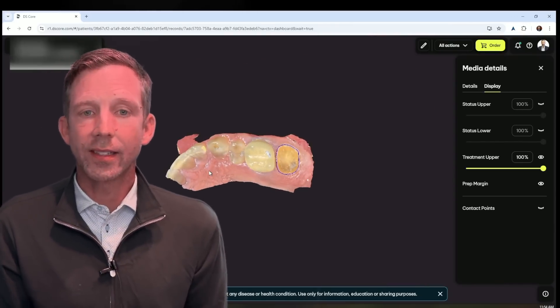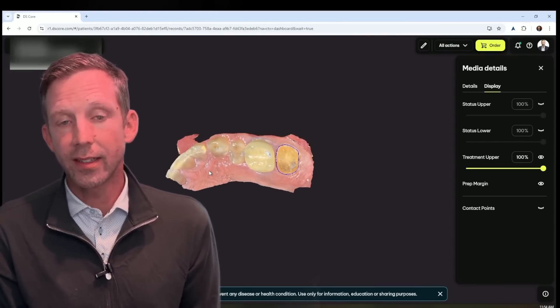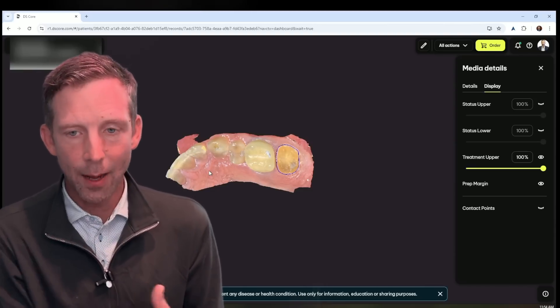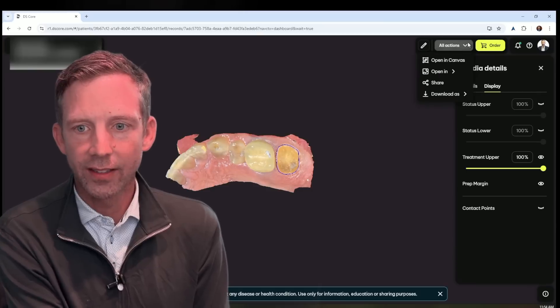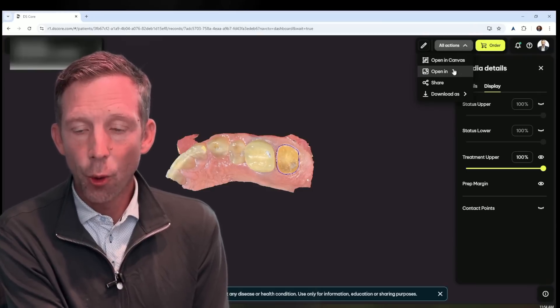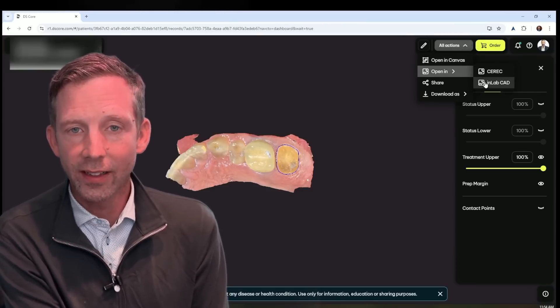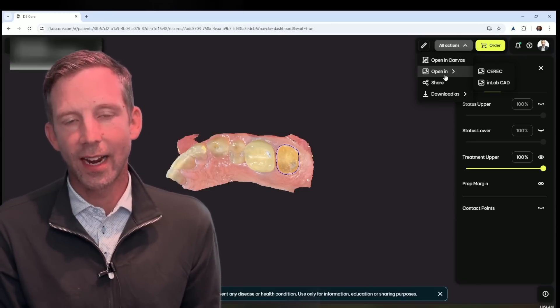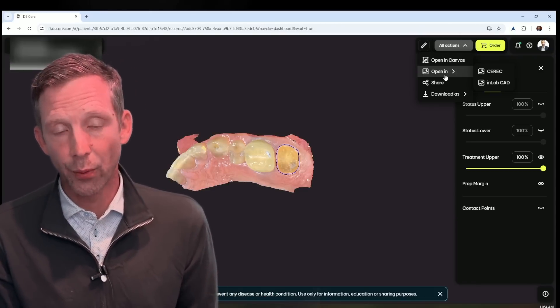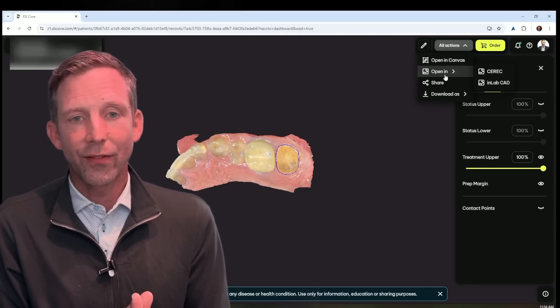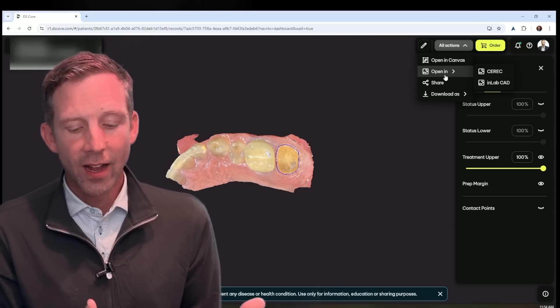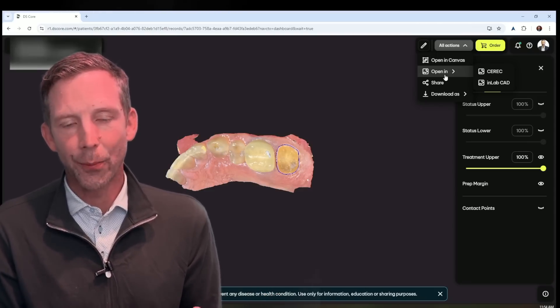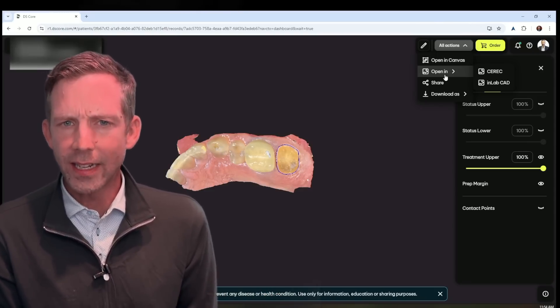Now, once you have this scan, you can either use it to send an order or send it to your lab. You can go to all actions and you can go ahead and open it in CEREC or in Lab. If you would like to go ahead and design this directly in your office via the hybrid workflow. So there's lots of options here available to you. The whole entire point is how the PrimeScan 2 just makes everything a little bit easier.